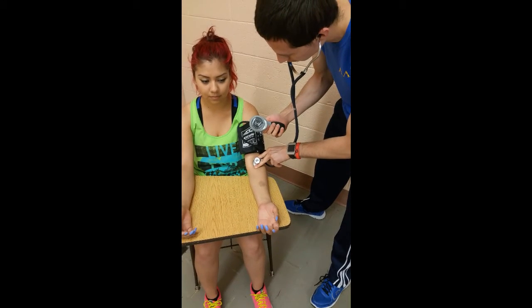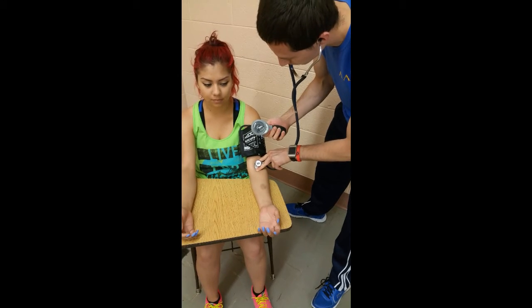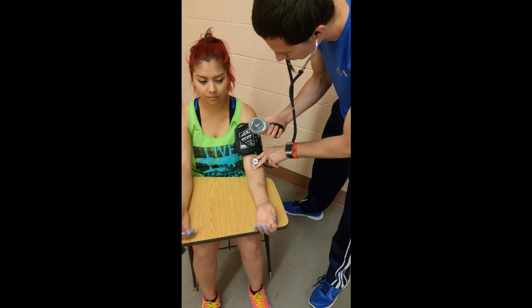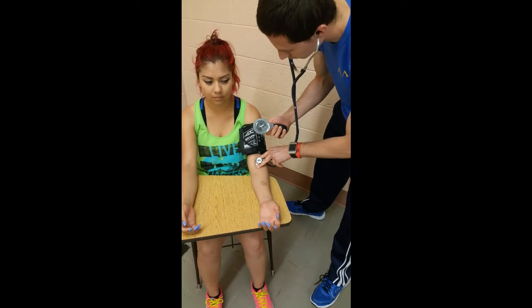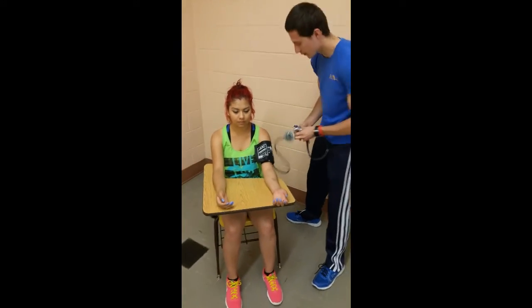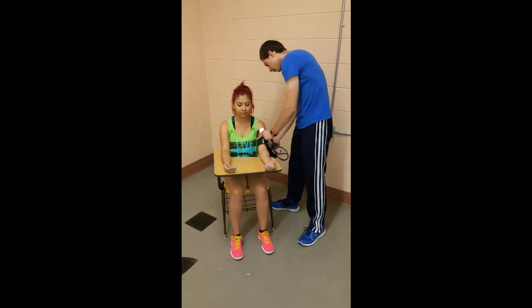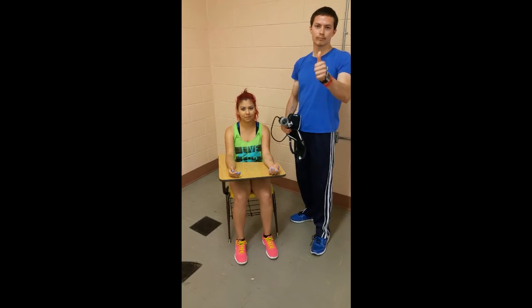Once you reach the desired pressure, start slowly releasing the pressure at a rate of 2 to 5 millimeters of mercury per second. Now listen for an initial muffling sound. This is called the systolic blood pressure. Keep listening until the muffling sounds disappear completely. This is symbolized by the diastolic blood pressure. Blood pressure values are given as systolic blood pressure over diastolic blood pressure.